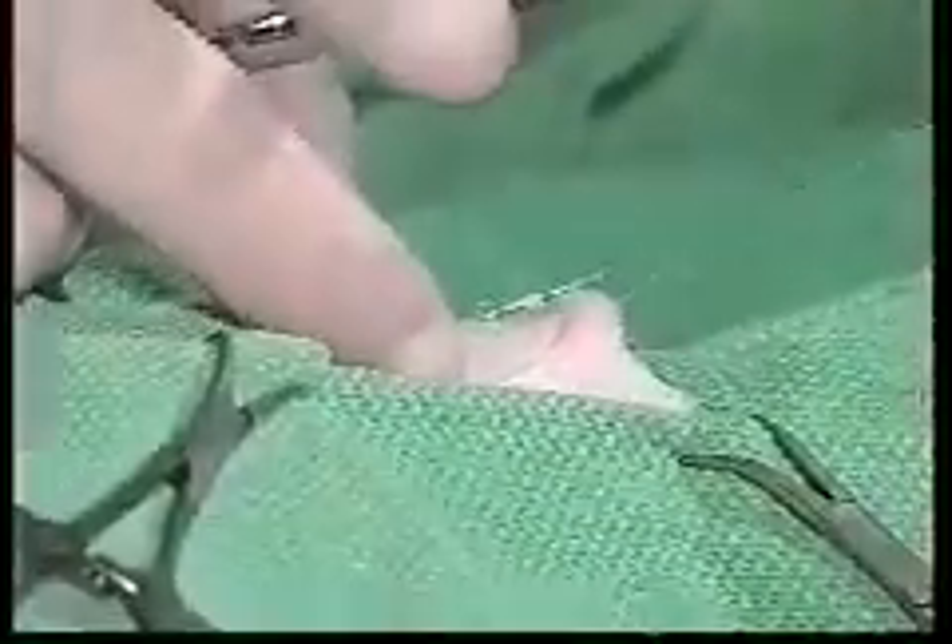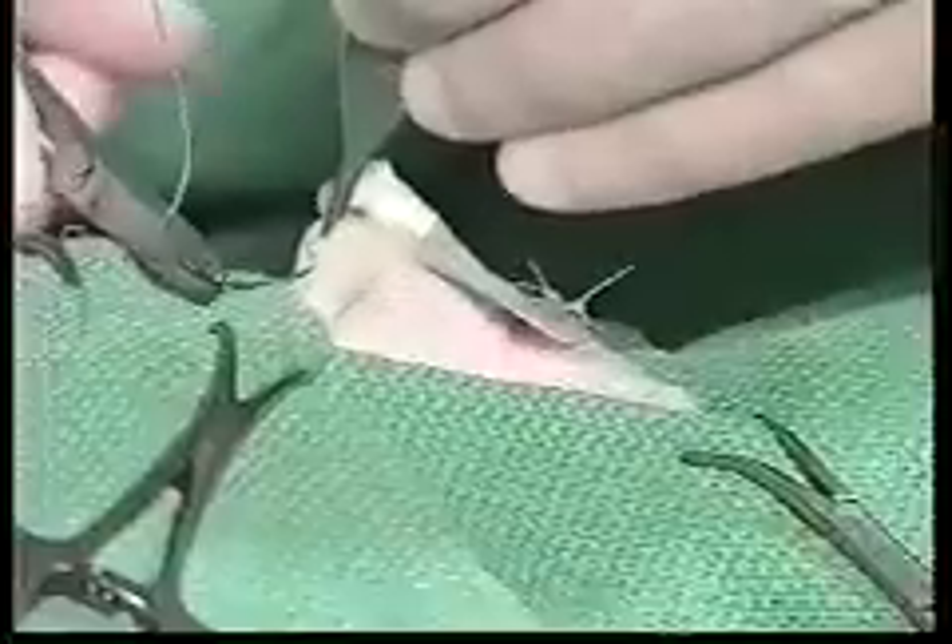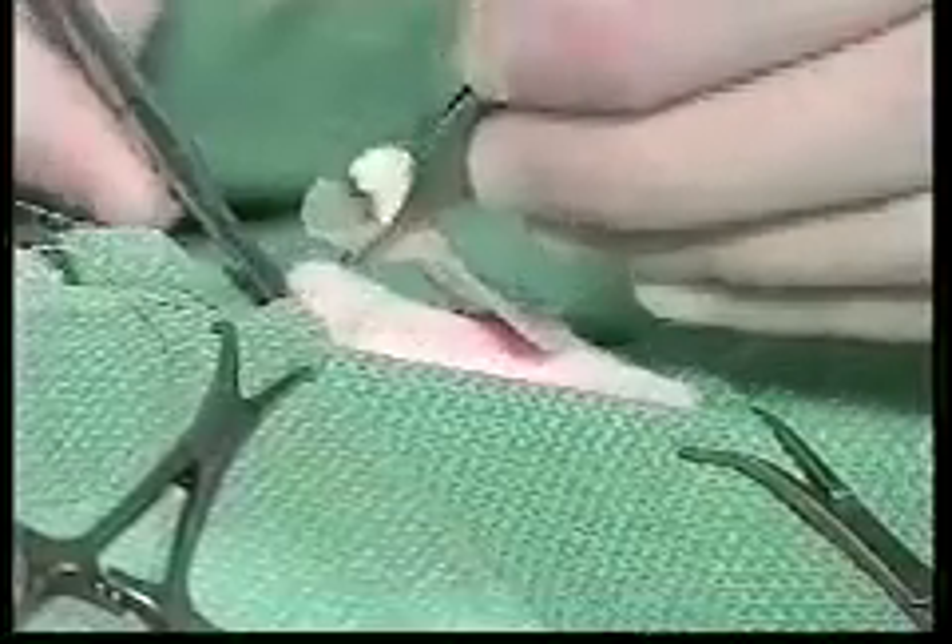What I have found is that if cats do break a stitch, the skin is not very sensitive there. They really don't object to placing or replacing a stitch without an anesthetic — they seem to respond more to the local than they do to the needle. The next stitch is going to be placed at the 12 o'clock position, and then we are just going to fill in around, taking about a quarter of an inch bite each time.